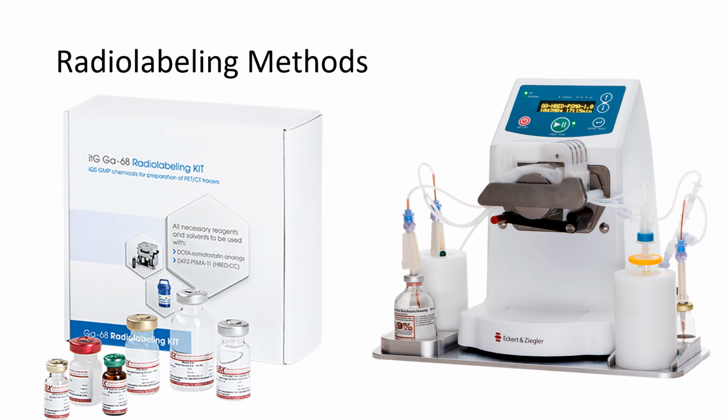And then the radiolabeling methods, it will be supplied in little cold kits like this with all the necessary reagents to either make the DOTA somatostatin analogs for neuroendocrine imaging or PSMA-11 for prostate cancer imaging.